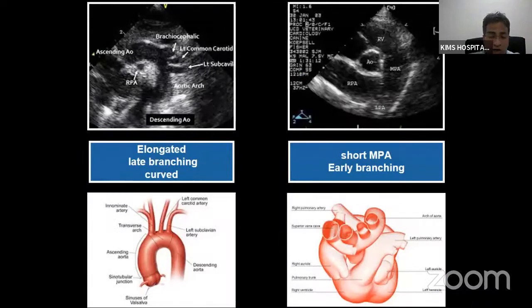So you know RA, LA, RV, and LV. Now, how do you determine the two vessels which are coming? This is a very important thing. The aorta will give branches only when it goes to the neck, so the aorta will never do early branching. Wherever the coronaries are attached, and if it's not ALCAPA, and there is no early branching, that is the aorta. But if you see early branching in the aorta, that may be a truncus, or one of the pulmonary arteries coming from the aorta.